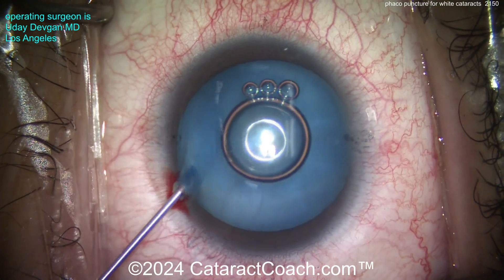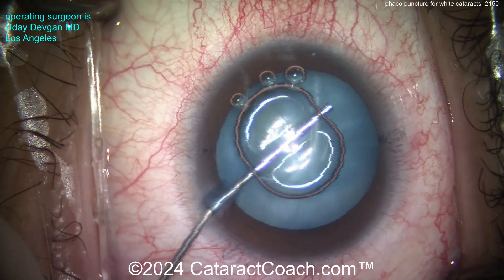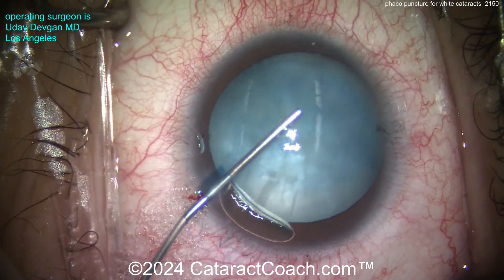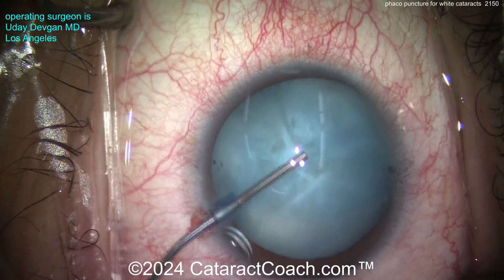The patient is relatively young. We've stained the capsule with trypan blue dye. As we inject the viscoelastic, you can see just how pressurized that capsule bag is — high intralenticular pressure. Touching the capsule, you can tell: high pressure.